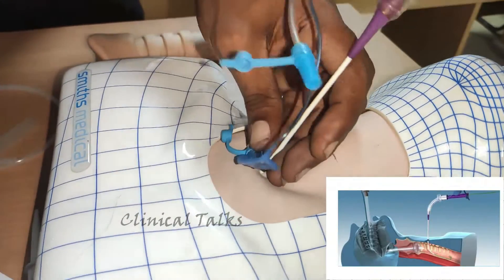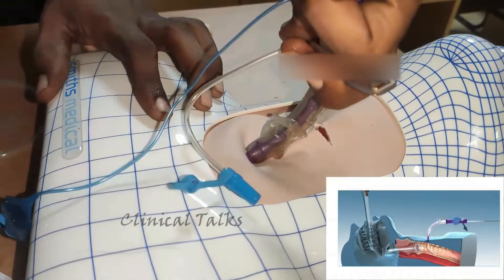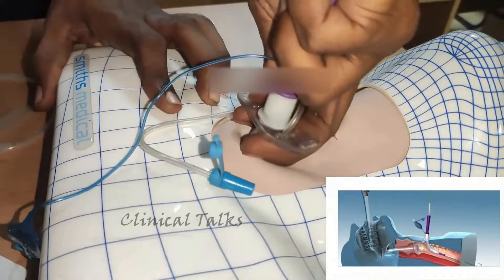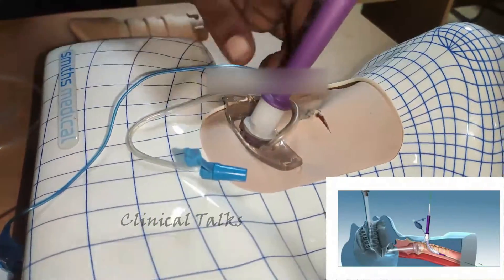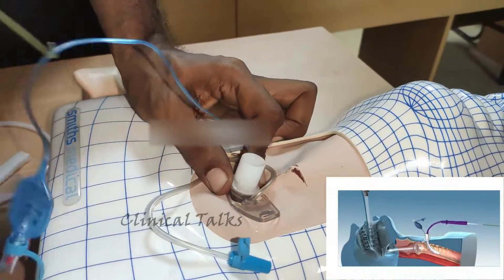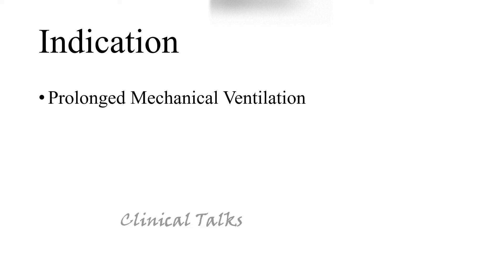Step 7. Pass the lubricated tracheostomy tube loaded onto its lubricated introducer over the guide wire guiding catheter assembly into the trachea with a slight twisting motion. Hold the tracheostomy tube flange and connector firmly while removing the introducer and guide wire guiding catheter assembly as a unit in an arc motion toward the patient's feet.